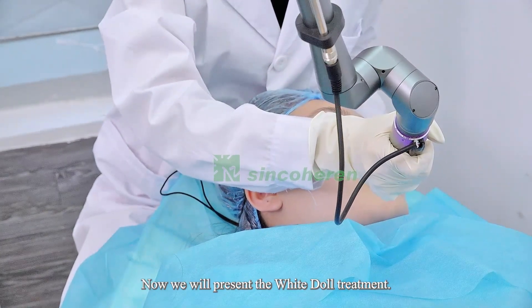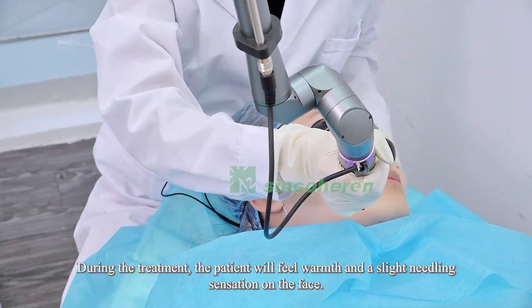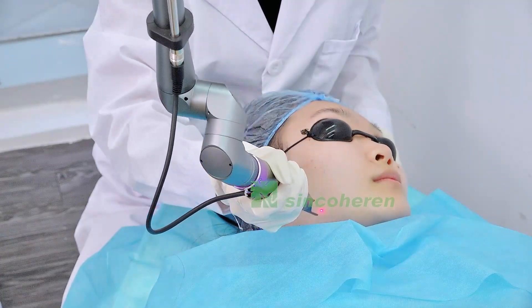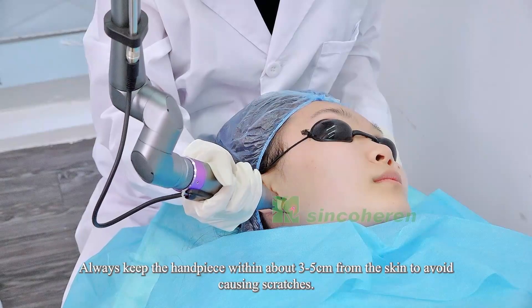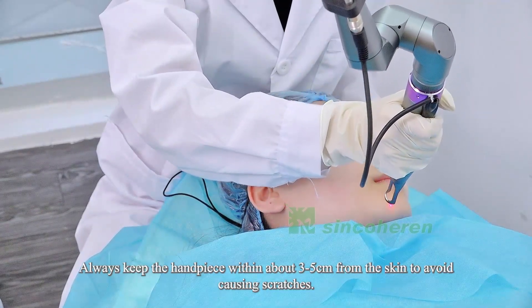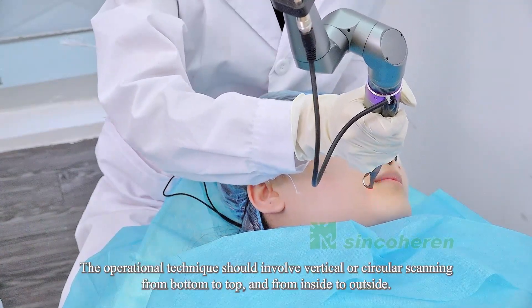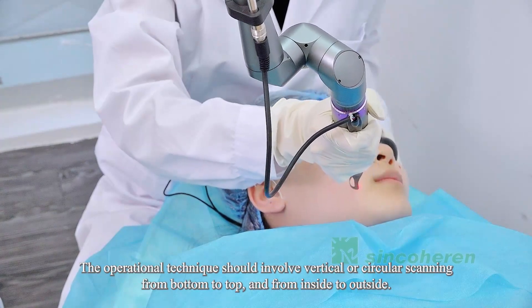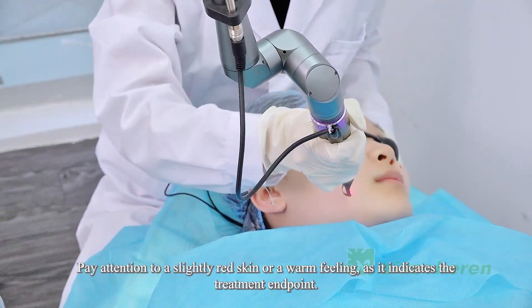Now we will present the white doll treatment. During the treatment, the patient will feel warmth and a slight needling sensation on the face. The handpiece should be vertical to the skin surface, and always kept within about 3 to 5 centimeters from the skin to avoid causing scratches.